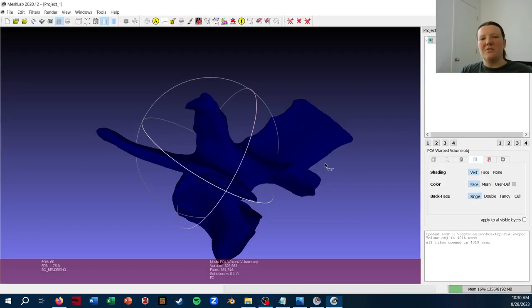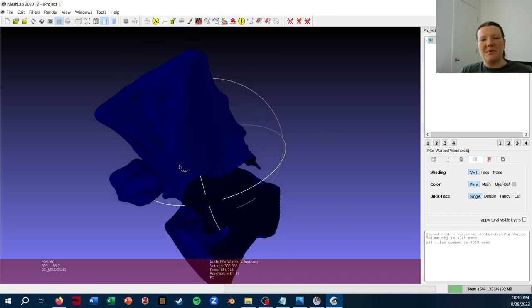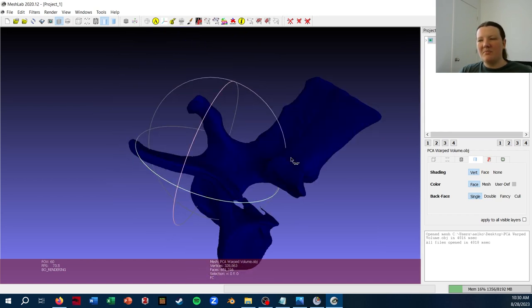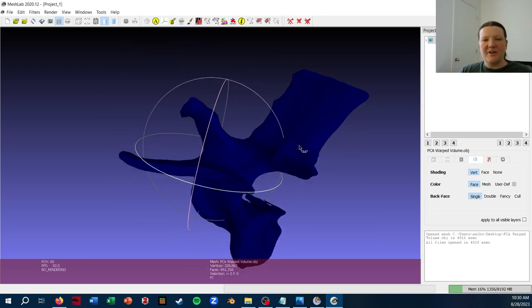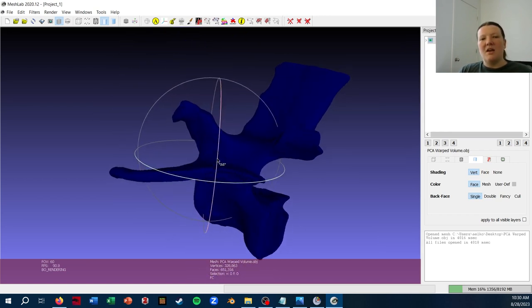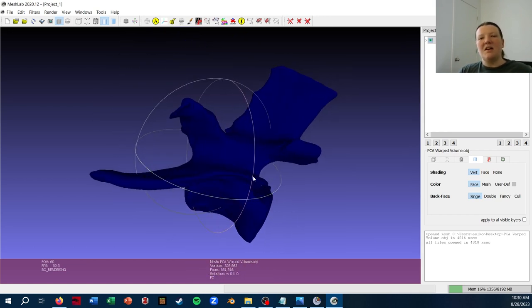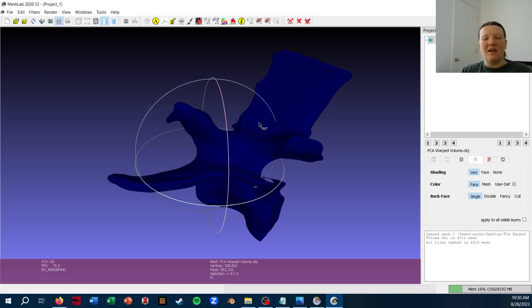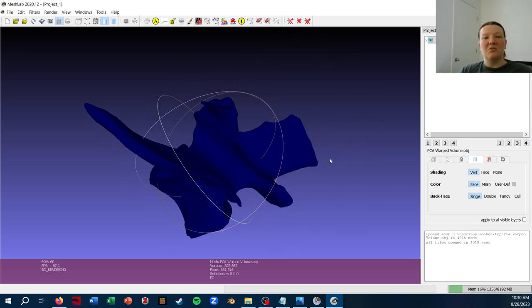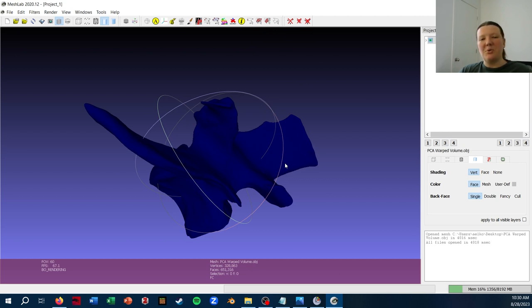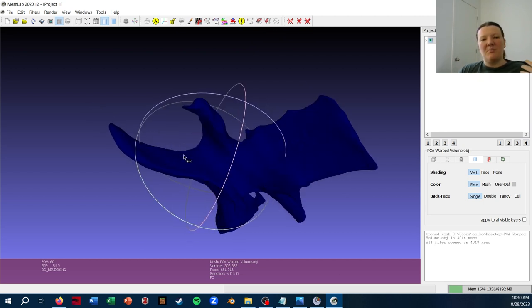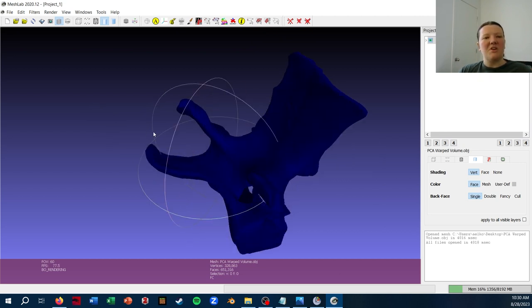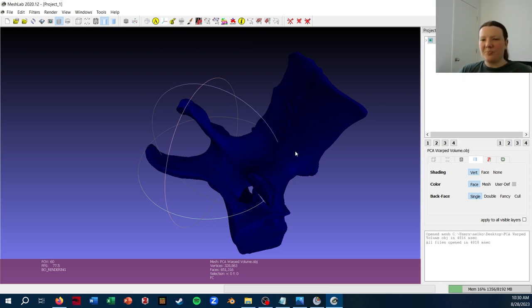And now I'm able to open this up in another program, MeshLab, and see that it has retained that warped shape. And I can do further edits on this, including removing the vertex color that is making it automatically blue, cutting off the transverse process since I don't want to visualize that, and whatever else.